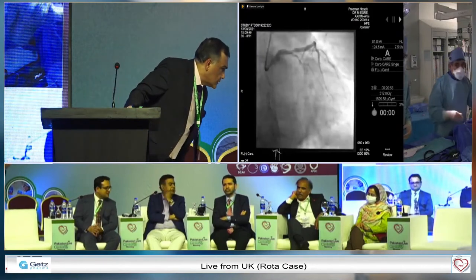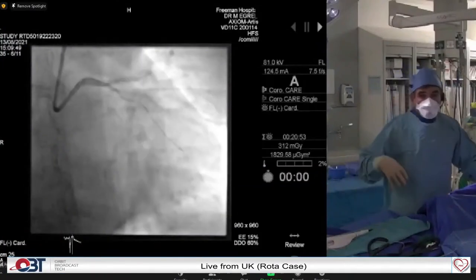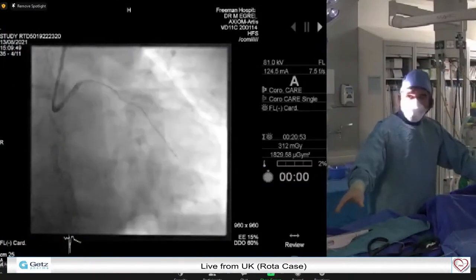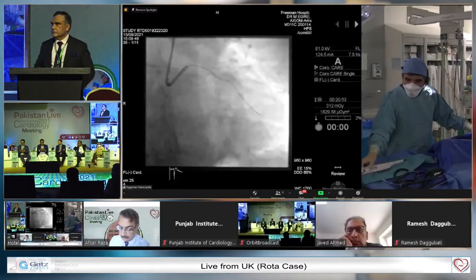So basically, taking the rota, I thought I'd show you this. Obviously, the RotaPro, we have lost the foot pedal. So basically, everything from here is controlled by the hand. Can we see the RotaPro, Martin? Can we put it on the table, please?